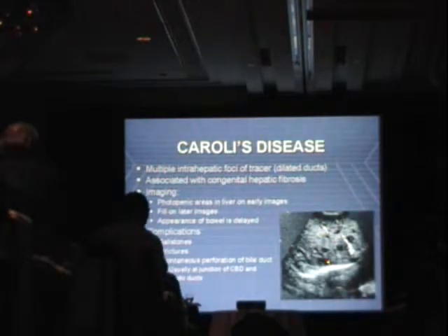Caroli's disease, multiple dilatations within the liver of the biliary ducts. What we expect is focal areas of tracer concentration within the liver, multiple areas. They can be photopenic on the early part and fill in later, and then there may be some delayed appearance of the small bowel.